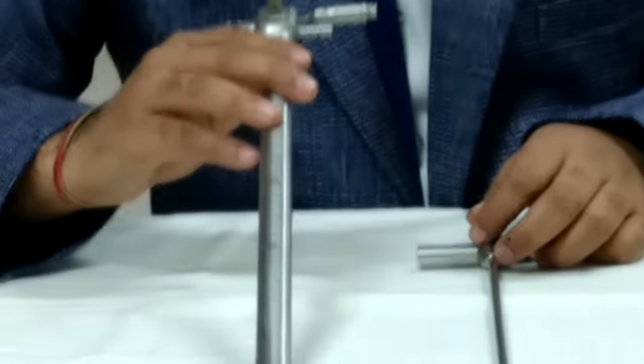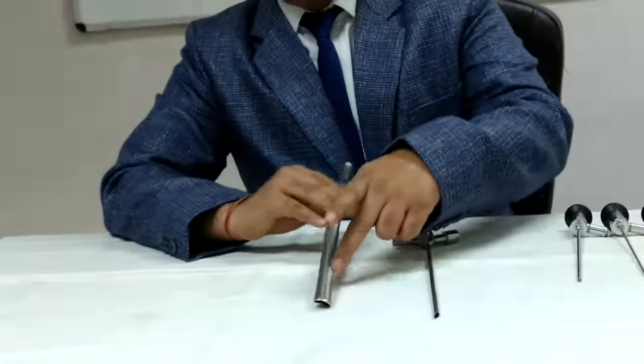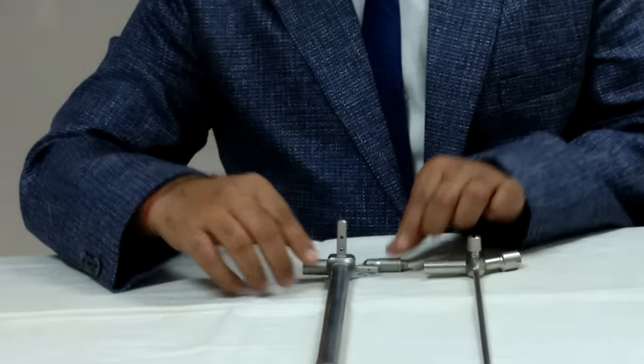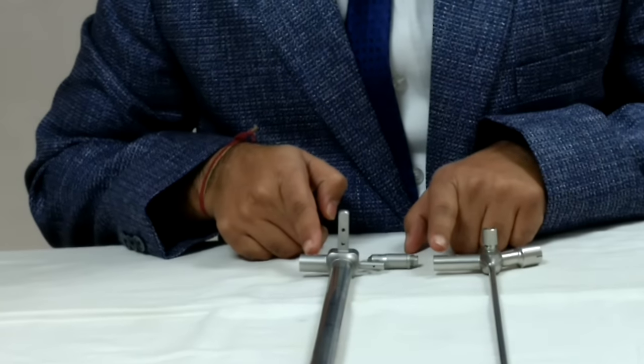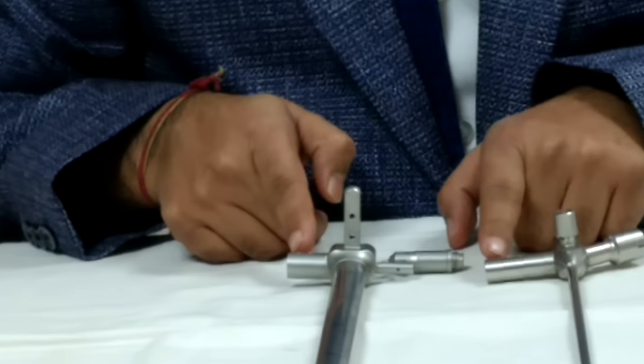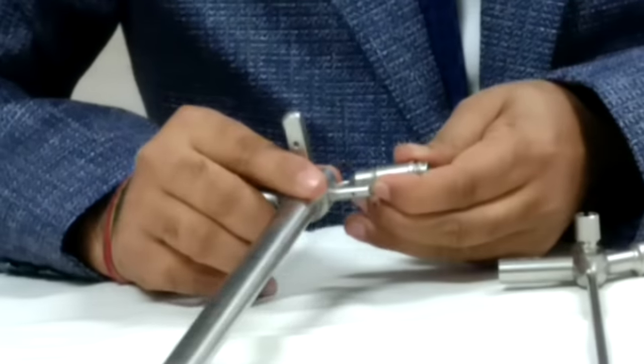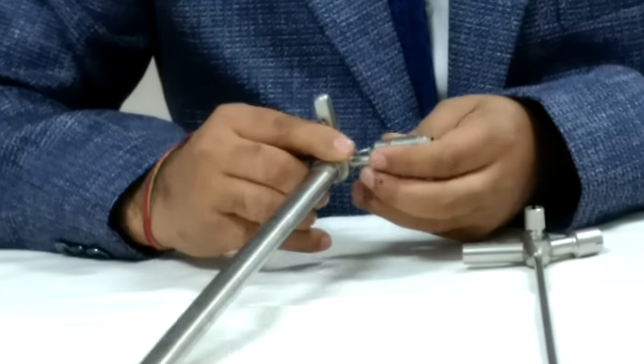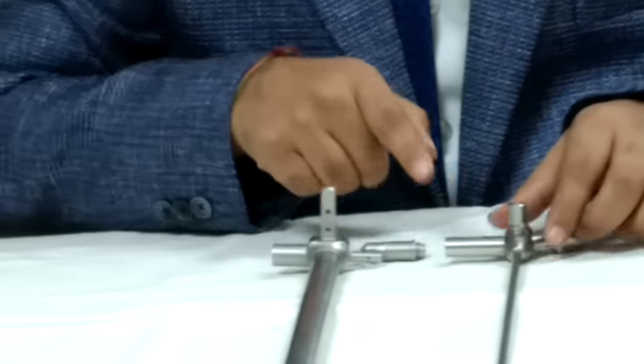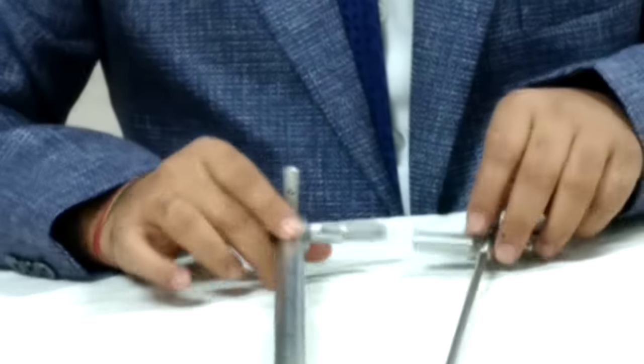This thing is not needed in esophagoscope, hence there are no vents in esophagoscope. You can see, both are having vents for light source. This is additionally having a light carrier, like how we saw in laryngoscope. Otherwise, these are an instrument.